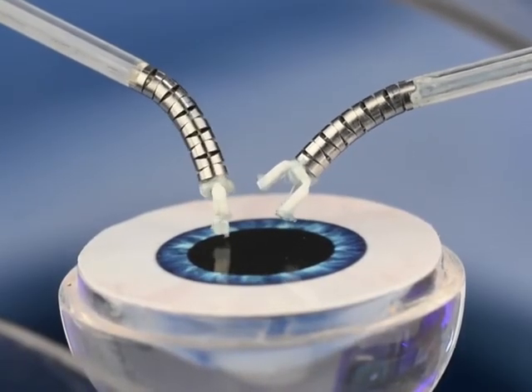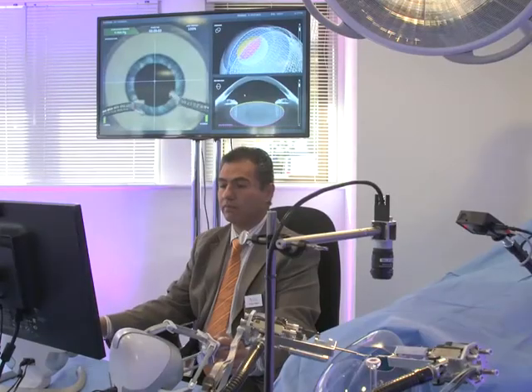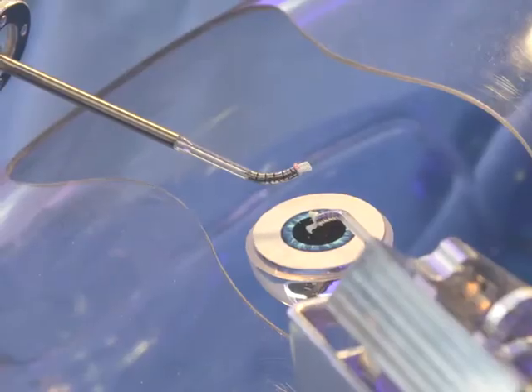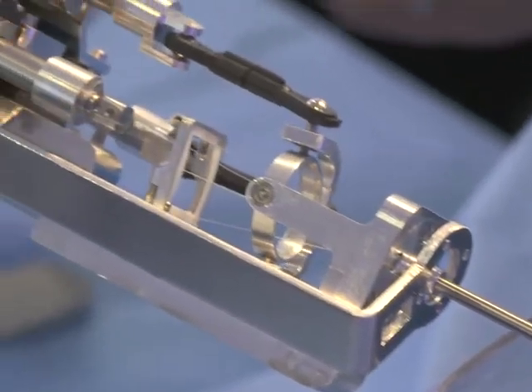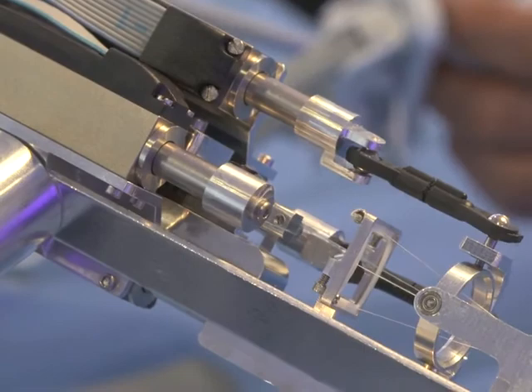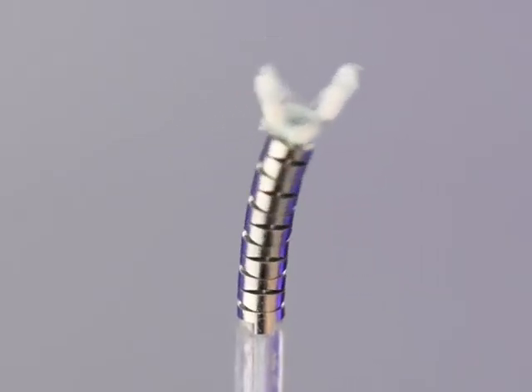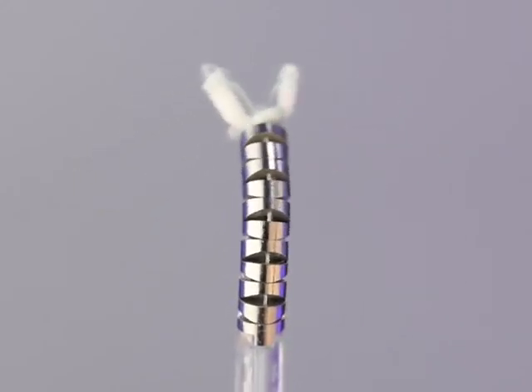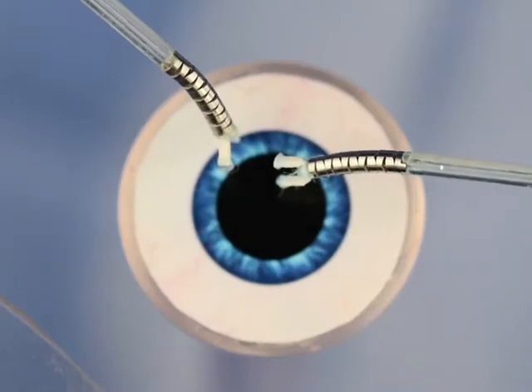The other one is making the observation about what I was trying to get at with pushing against the body wall, and the motion of the robots on the outside of the body conflicting with the other arms. That comes from having to control a long, straight instrument, which offers good benefits in terms of stiffness at the tip of the robot, which is good for applying forces onto the environment, but is difficult in terms of keeping your external robot small.